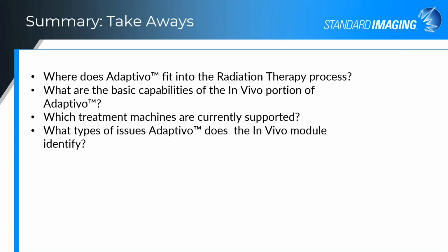And the goal is to make the tool work for you, not against you. So for those that would potentially be looking at purchasing and starting the program, we recommend starting small, picking out the cases that you're interested in, and ramping up as you get comfortable with the criteria that you would want to set in your clinic.